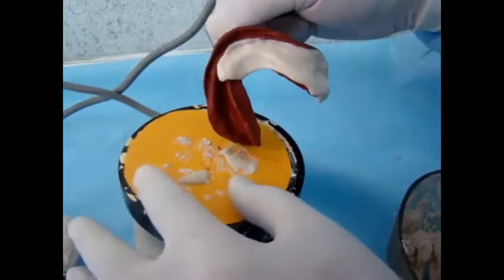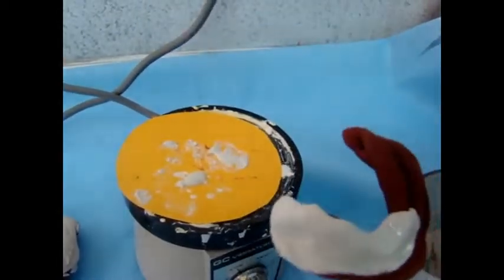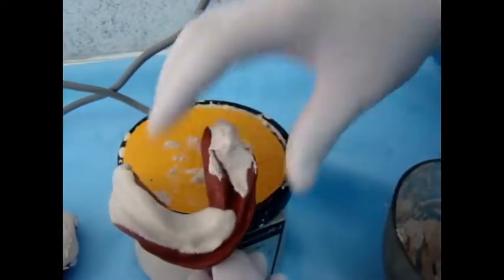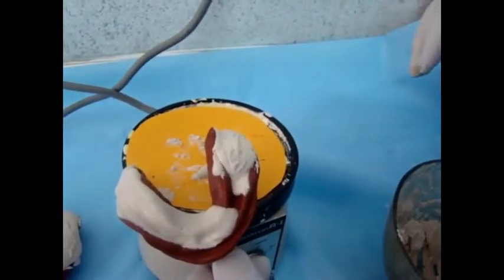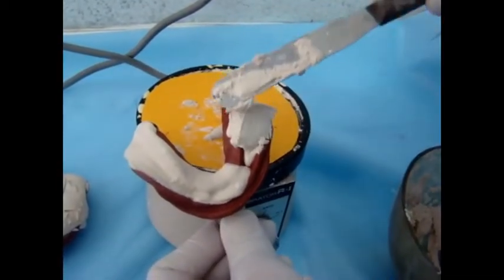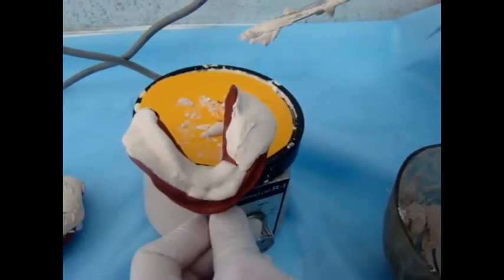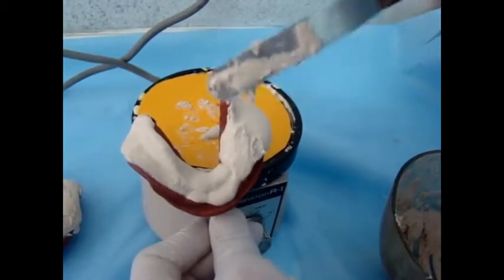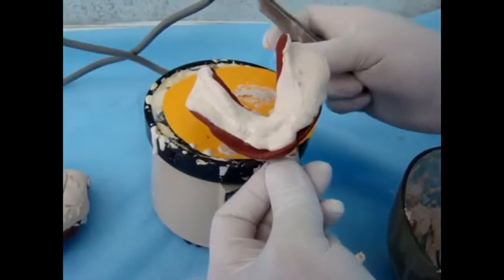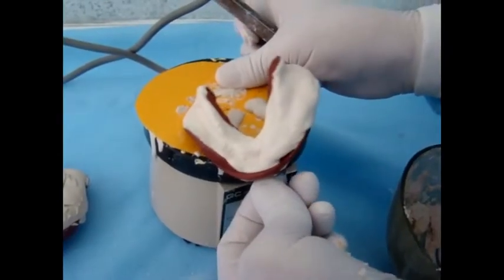Here is the lower impression. We start by placing the plaster of Paris at one side and the material is left to cover the impression and flow to the other side on the vibrator. By this we make sure that no air bubbles are trapped on the surface of the cast.